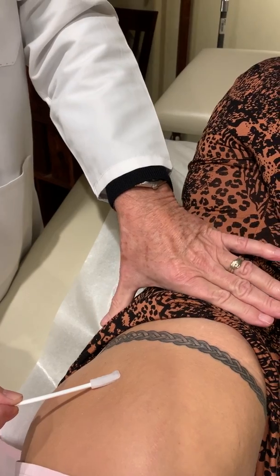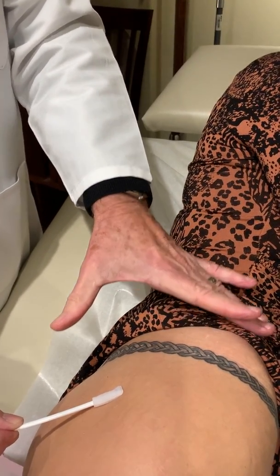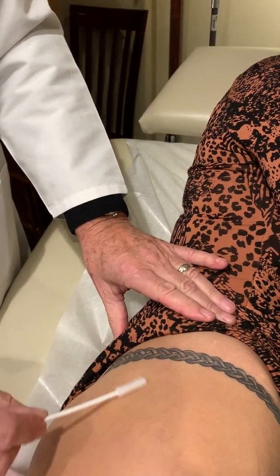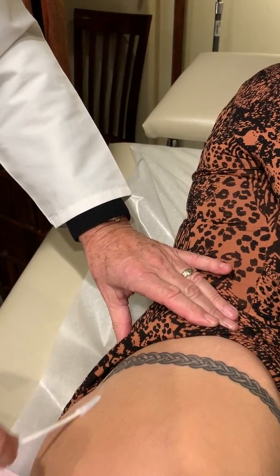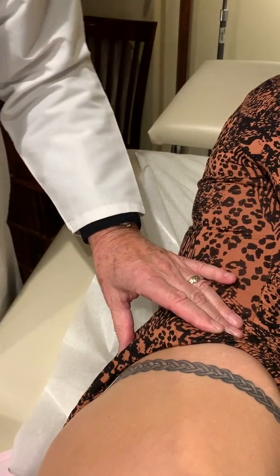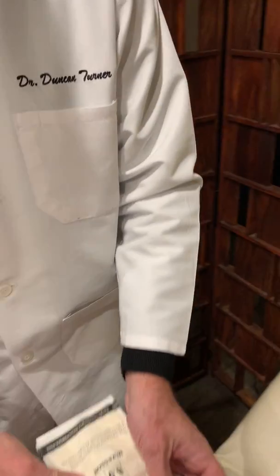We've chosen this area in the right buttock and we mapped out some guidelines and guide points here so we get into the right place and decrease the risk of any particular complication, which could be injecting into a nerve or blood vessel. We apply antiseptic solution on the skin and then adopt a sterile technique.